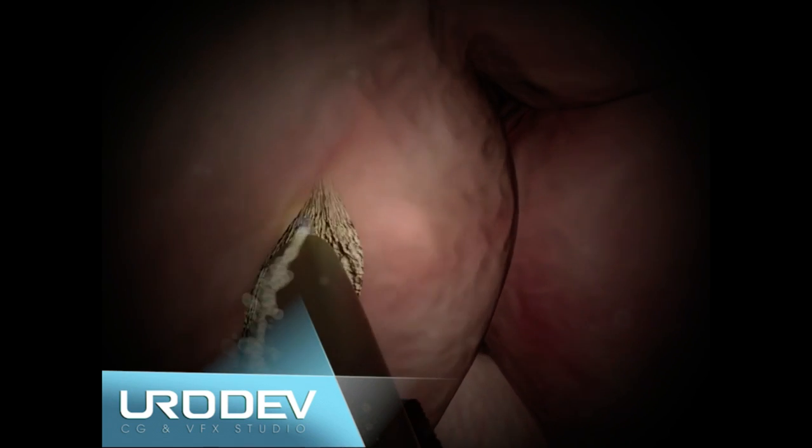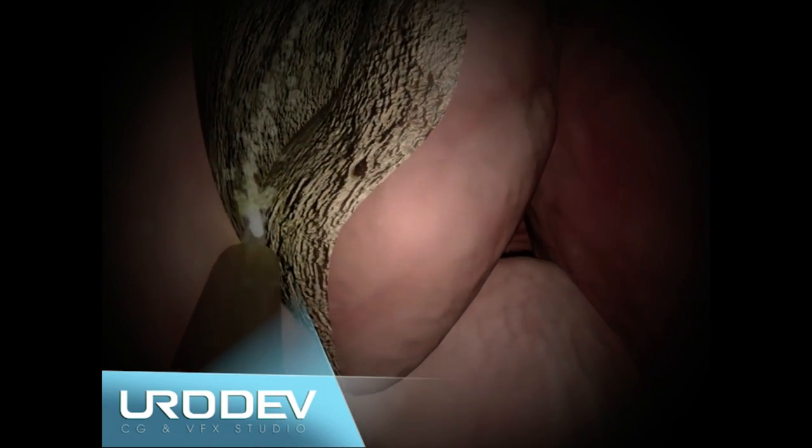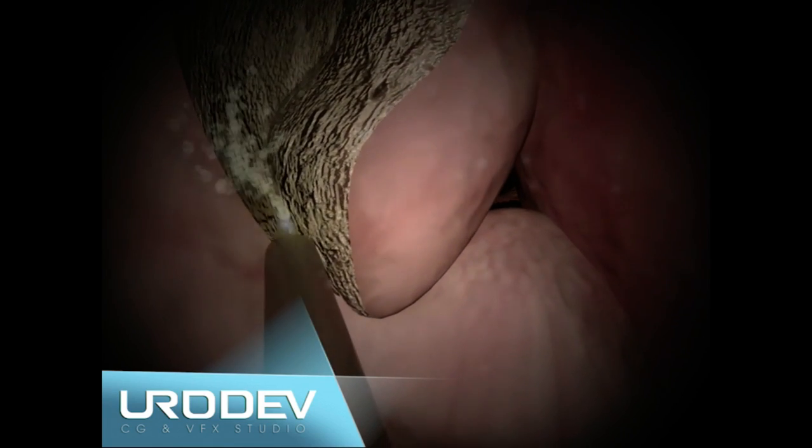The laser shaft dissects hyperplastic tissue from the capsule, developing an existing dissection plane. Prostatic tissue will finally be pushed into the bladder.